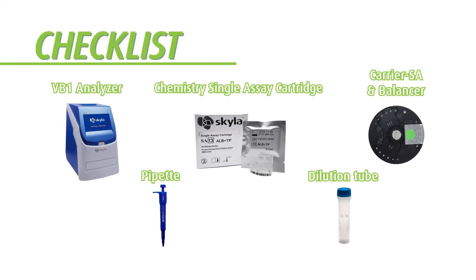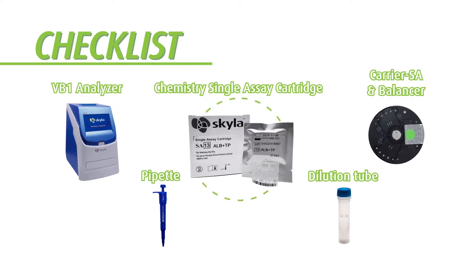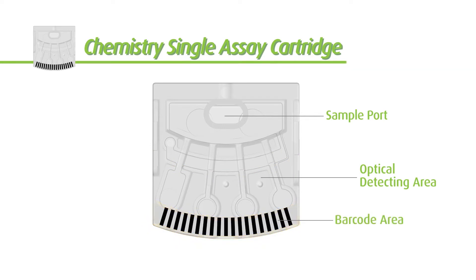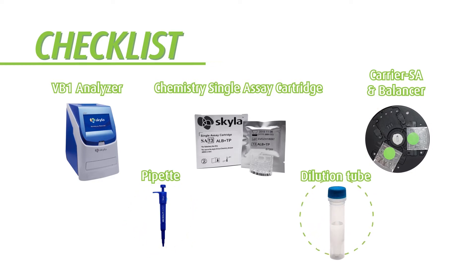Let's quickly check if all major materials are ready before the test can be performed: the skyla VB1 Analyzer, chemistry single assay cartridge. Samples should be injected into the sample port. The optical detecting area contains reaction wells and reagent beads. The barcode label contains serial number, batch number, and valid date of the reagent disk. Also needed: analysis carrier and balancer, and a pipette.